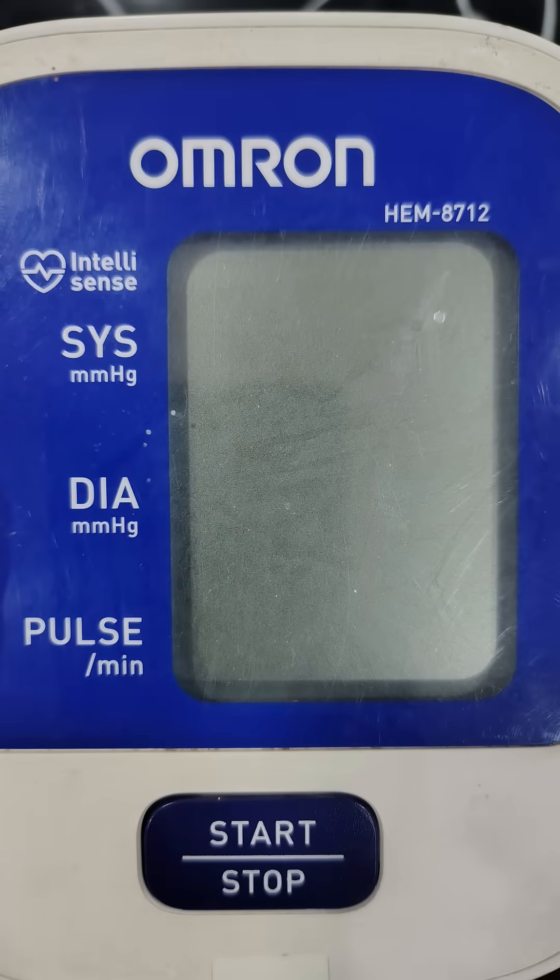Rule 7: If you have a high-risk patient at home, try to take 2 readings every day — one in the morning before coffee or medications, and one in the evening. Do try to use WHO-validated devices like OMRON.